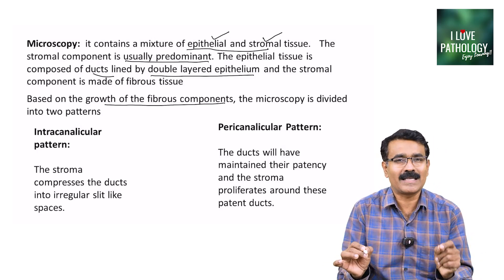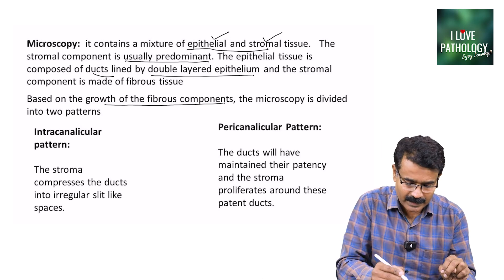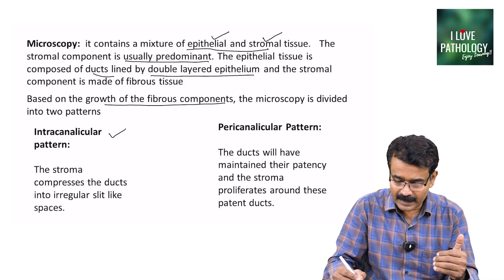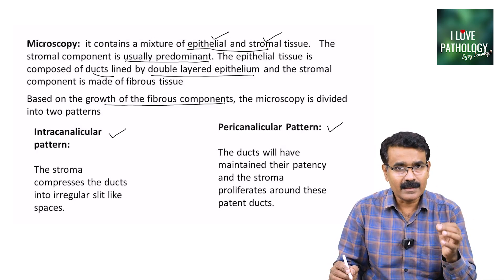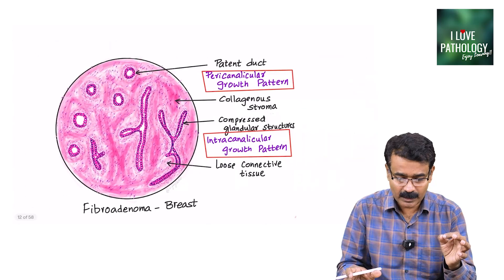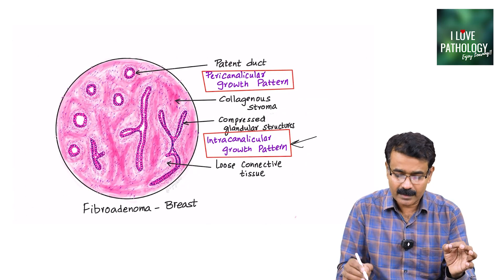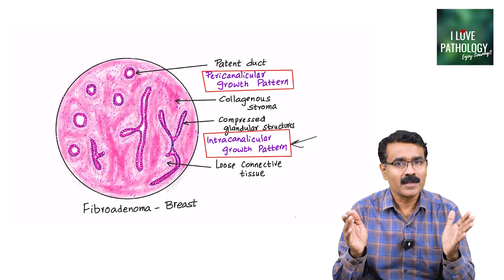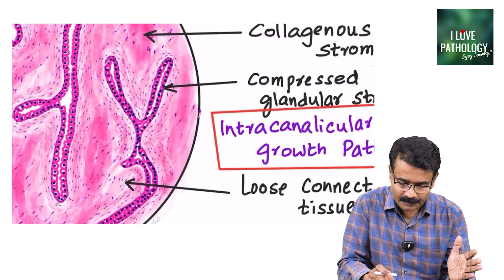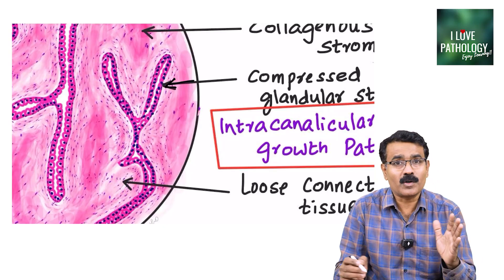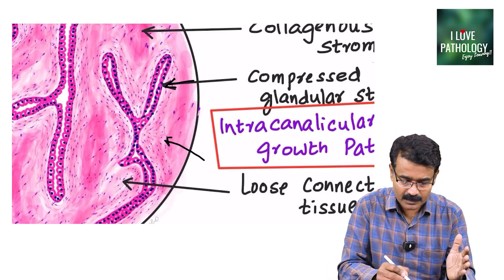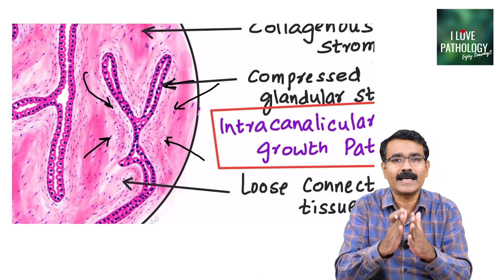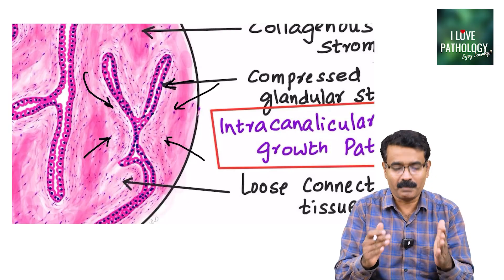Based on the growth of the fibrous component, the microscopy of fibroadenoma is classically divided into two patterns. In the intracanalicular pattern, the glands get compressed by the proliferation of the fibrous stroma. The fibrous stroma proliferates and compresses the glandular structures into slit-like spaces — that is the intracanalicular pattern.